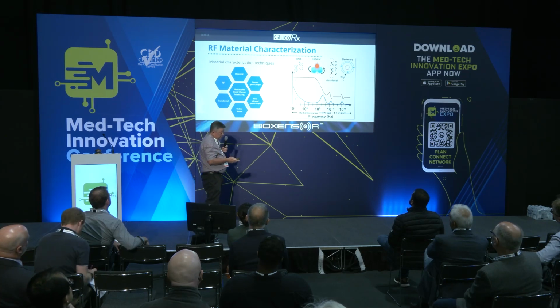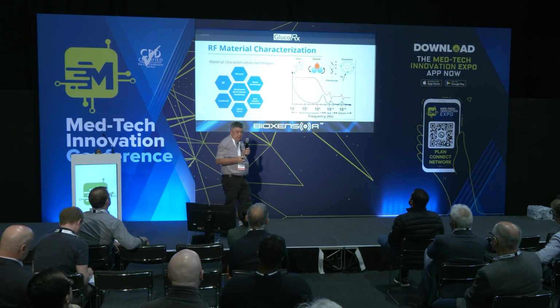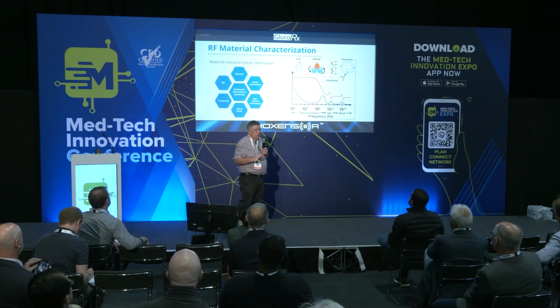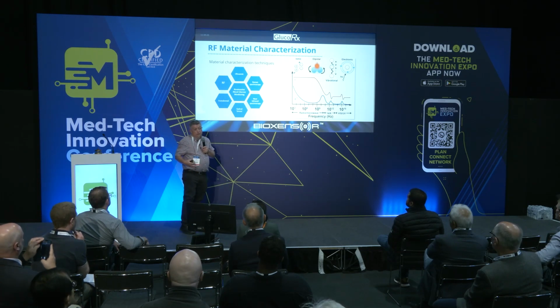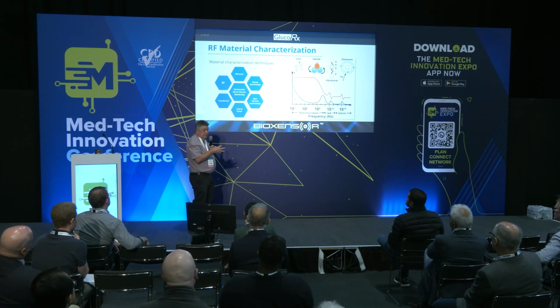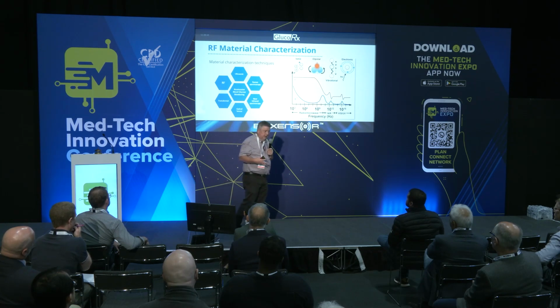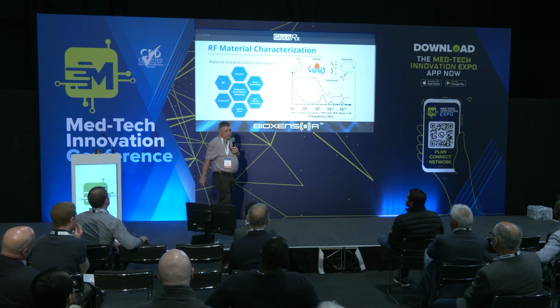Now, what we're talking about are RF frequencies, and they actually tend to cause things like water molecules to rotate, all right? It's that rotation and the friction because of that rotation that gives rise to heating of microwaves in domestic cooking, all right? What we're doing by targeting that particular rotation is to look at its disruption, the disruption of the hydrogen bonding network by adding something to water. In this case, it's the presence of glucose.